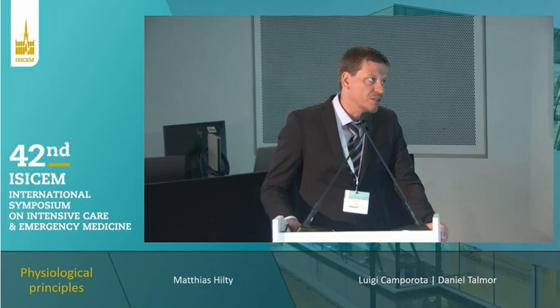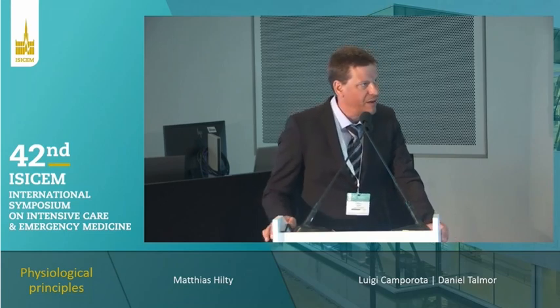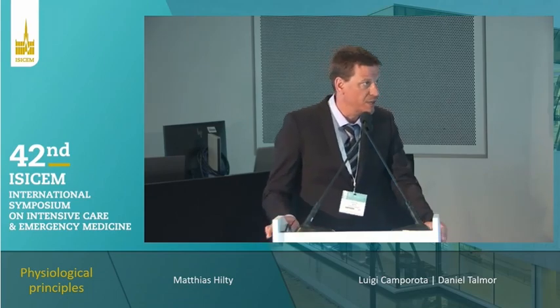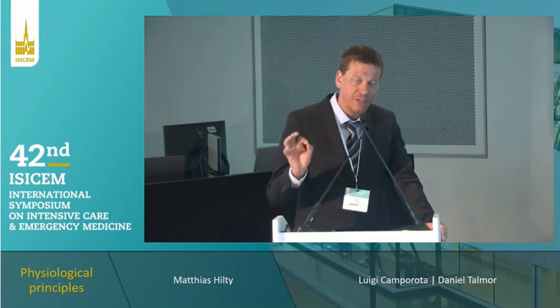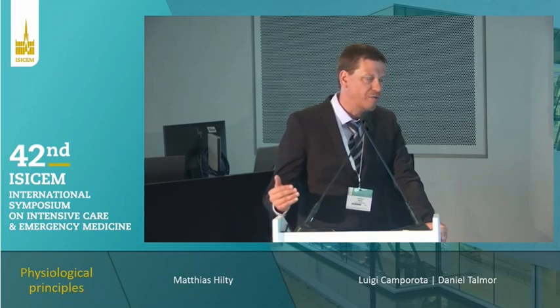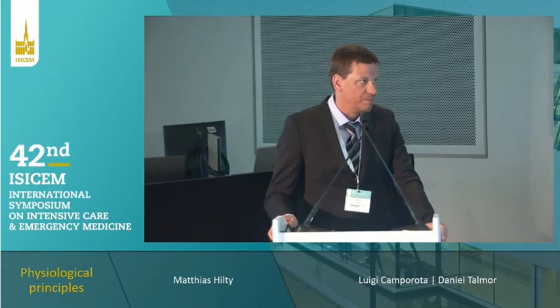There are other considerations, for example, the permissive hypercapnia. It's very unclear how much of the permissive hypercapnia is really something we want to tolerate, because there are positive and negative effects associated with it, and the data is not very clear. So individually in some patients, it could be beneficial to reduce the amount of hypercapnia that we must tolerate to protect the lung using ECCO2R.